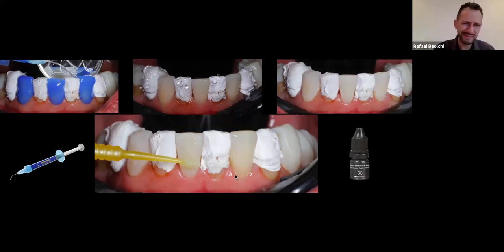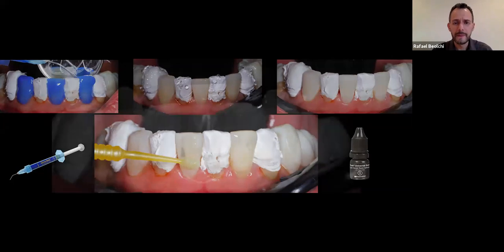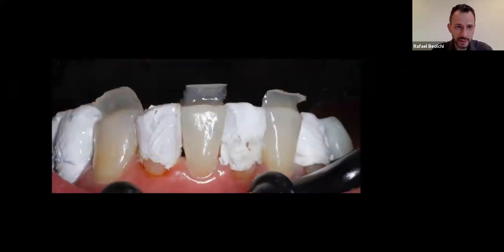You guys will see. So again, etching, washing, drying, bonding, all of the things. This is one of the challenges. It is really tall. It is really 3 millimeters tall. It is a lot. It is definitely a lot. I need to be sure of 3 things here. I need to be sure that occlusion is not only good, it is perfect. And I know that because I know who did it. I know that Marcelo took care of that. So there's no excuse. I cannot use occlusion as an excuse because it is balanced.